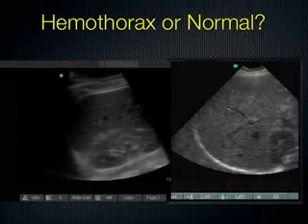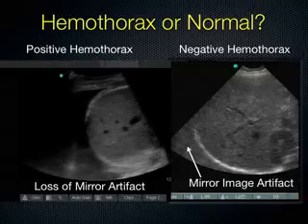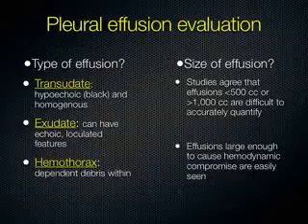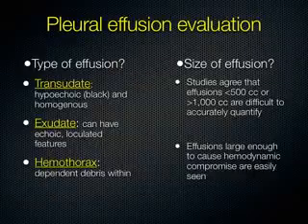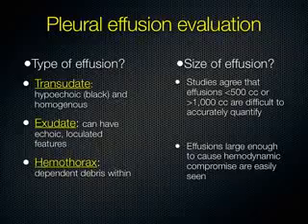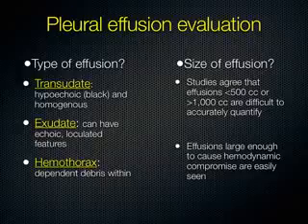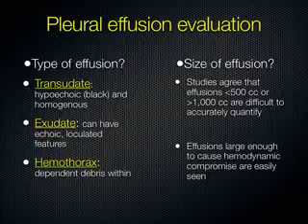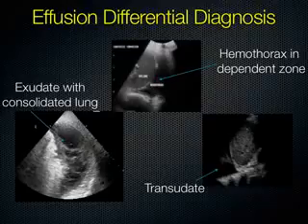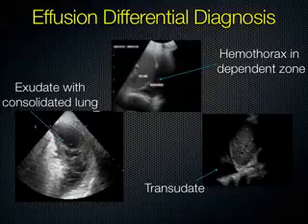I've mentioned transudative versus exudative effusion, and hemothorax. Sometimes you can tell the nature of the effusion, and it guides your management. For instance, if you're thinking about just putting a very thin needle into the effusion to drain it, thoracentesis, you might not choose to do that if you have something that looks very thick with fibrinous loculations or blood in it, because you need to manage those differently. So it does help. It's not diagnostic. You should never say this is transudate versus exudate based on what the ultrasound looks like, because you need to send it to the lab to be sure, but you can pretty much tell when you look at it if you're going to need a needle or a chest tube to drain it. So it's very helpful for that.